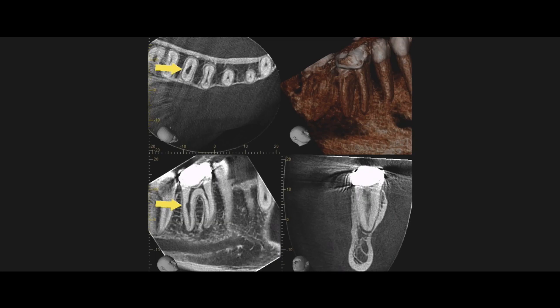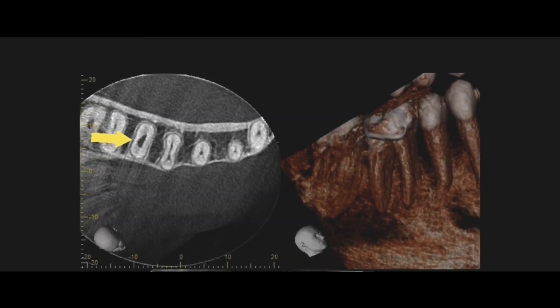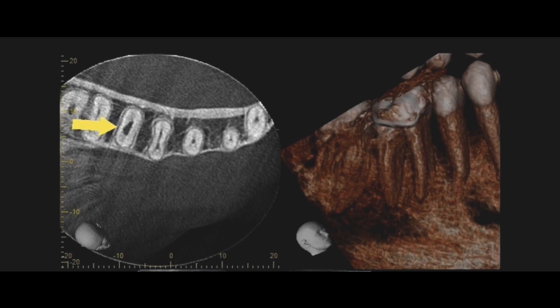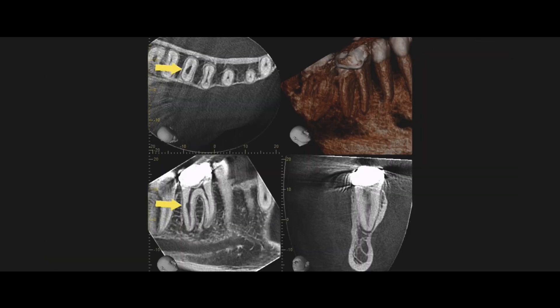This is really where the cone beam comes in handy. Endodontists using cone beams all have the idea that it's helpful in every single case — and in this case it's not only helpful to tell us where the resorptive lesion is located, but also the actual root anatomy. We know a lot of roots are kidney-shaped, and if this distal root was kidney-shaped it would be hiding the perforation because you wouldn't be able to see it on a PA. In this case we can see there is some bone loss towards the distal, some tooth loss towards the distal, but there's enough tooth structure that I felt confident we could go in using the microscope to remove that defect internally, disinfect it, and actually obturate the whole system and get a good result.